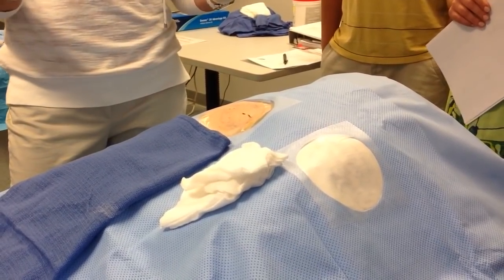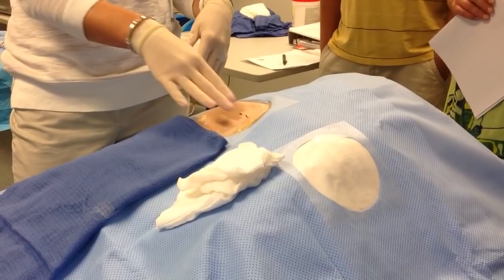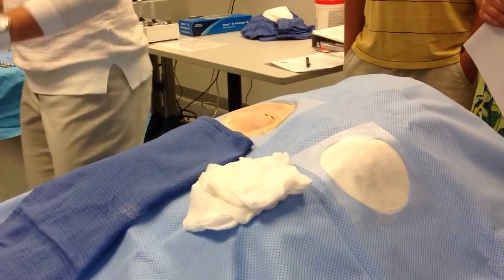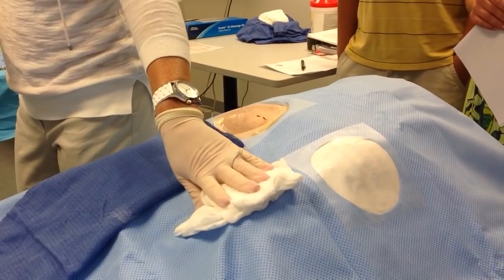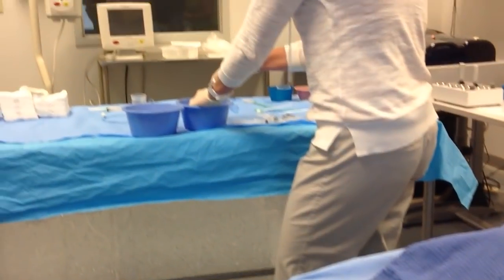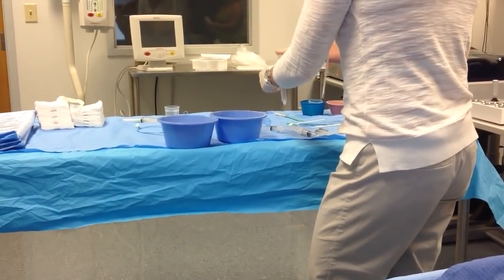And even though you have sterile gloves on, you still don't want to keep touching here and everything. Okay? So we lay a little tablecloth here. We put some gauze here. We bring everything over. We flush everything on the tray.